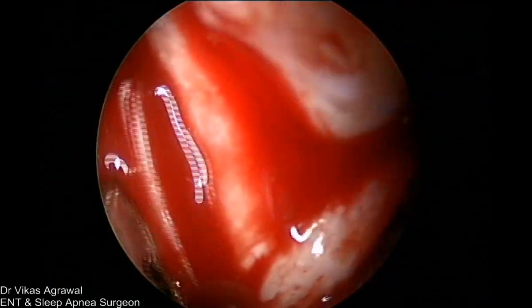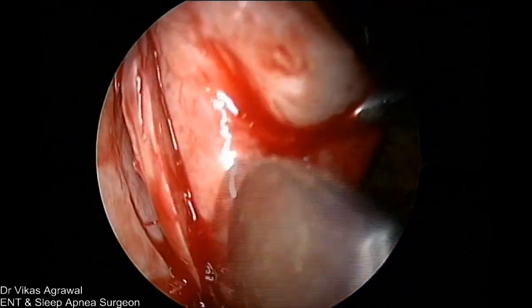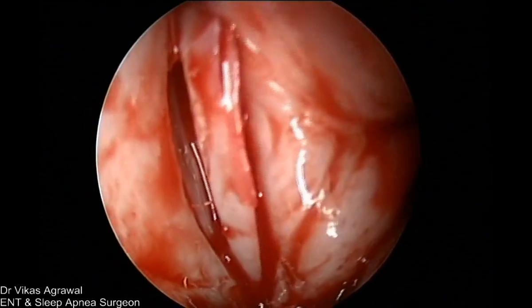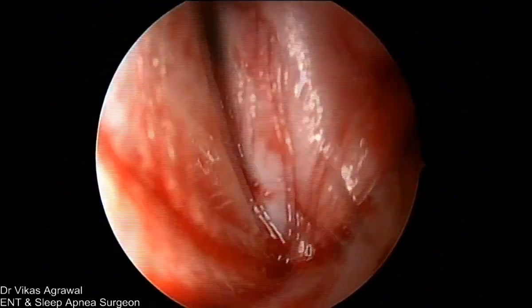Okay, so here we are. As you have seen, we have already lifted the flap, and I am now lifting the flap onto the other side. See, I have not gone till the junction of the bone and the cartilage. I am removing this much of the cartilage because this is a high cartilage deviation. If we do not remove it, the patient will not get relief.